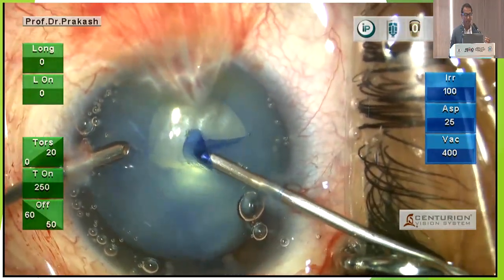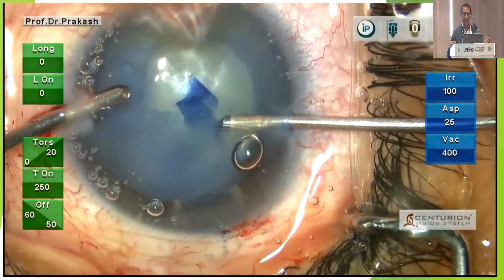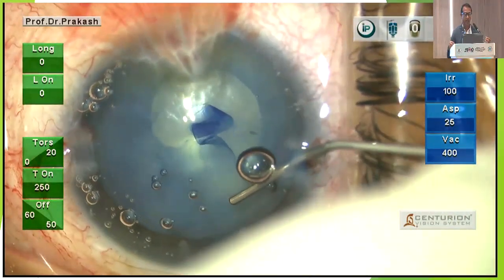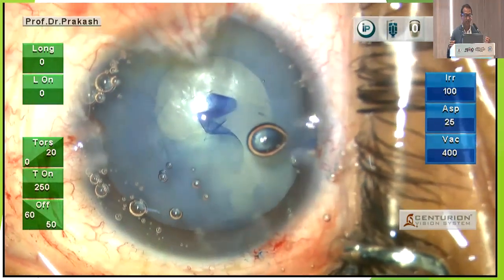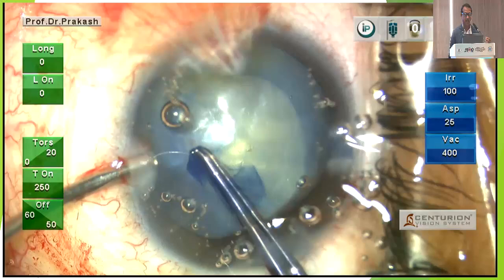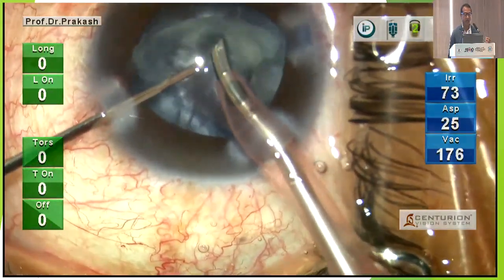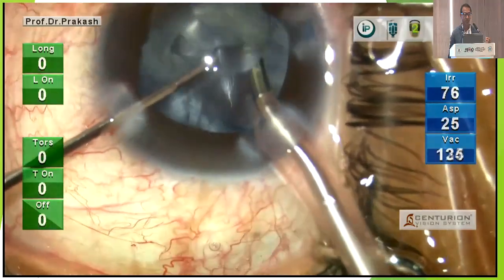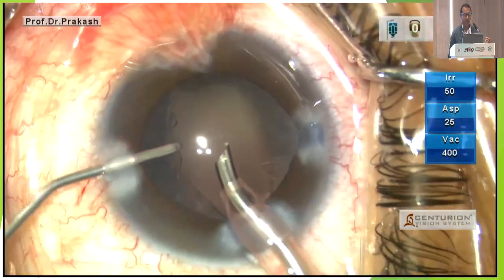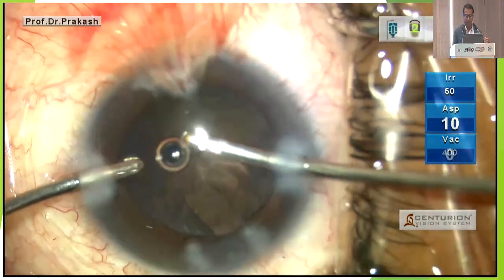This is again another case. You can see, to maintain the stability of the anterior chamber, I was doing the rhexis through the side port with micro scissors. But even then, when it ran into the periphery, with the same technique and same principle, I gave a cut into the anterior capsule and enlarged the rhexis size. And with slow motion phaco, using low parameters, I take out the lens matter, inject dispersive OVD through the side port, and implant the IOL into the bag.